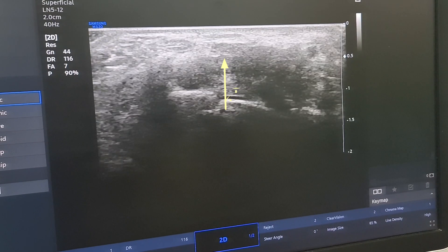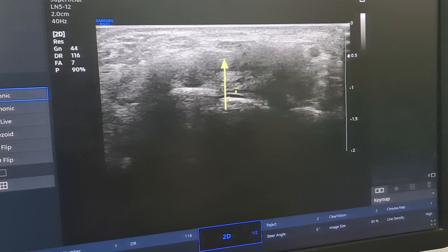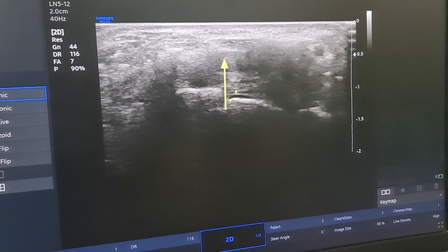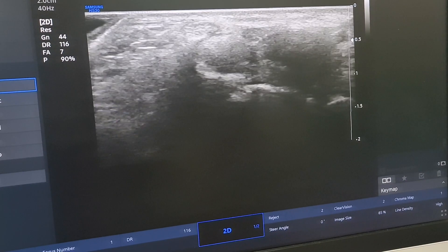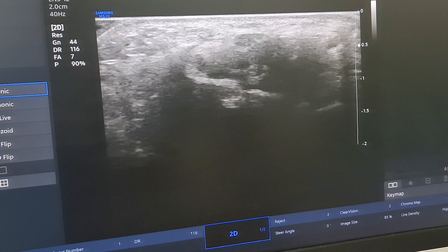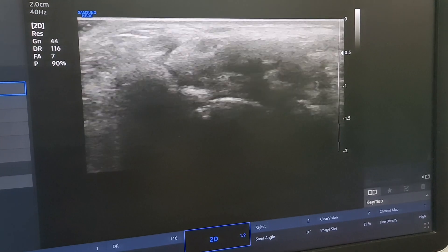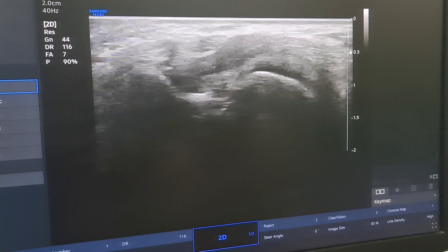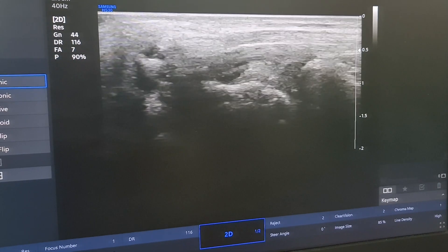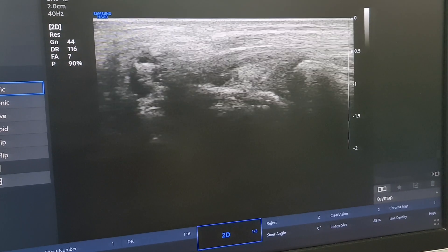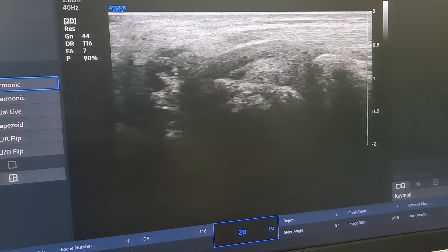You can observe finger movement. The nerve is free in the wrist. Now we are going for longitudinal section of the median nerve. This is the median nerve and we again confirm it by the finger movement.